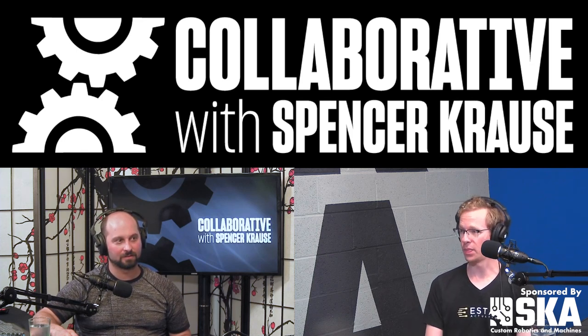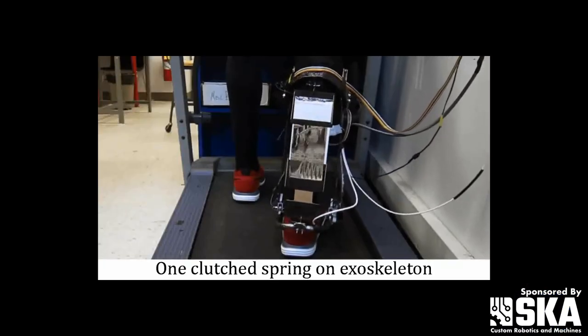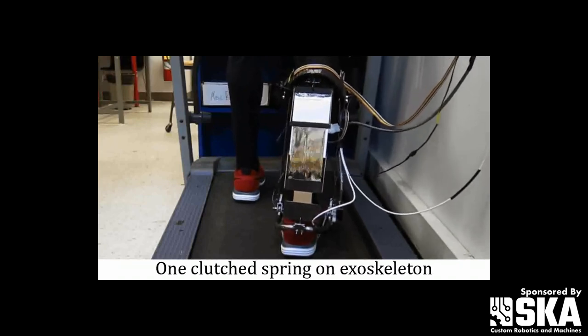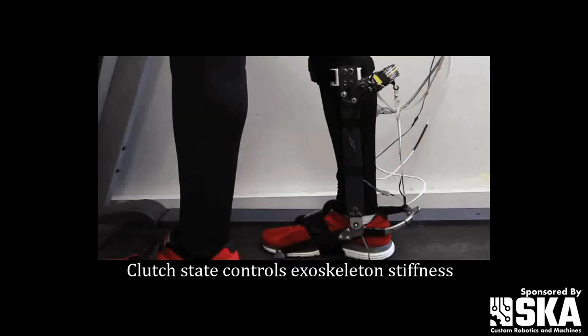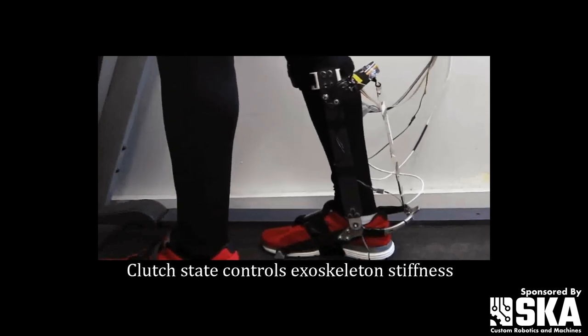One of the things that I did during my PhD — and there's some video on YouTube as well — was use clutches in a walking exoskeleton that assists you on the ankle. It replicates the assistance pattern from a previous study that showed you can reduce the metabolic cost of walking by 6% compared to not wearing the exoskeleton.